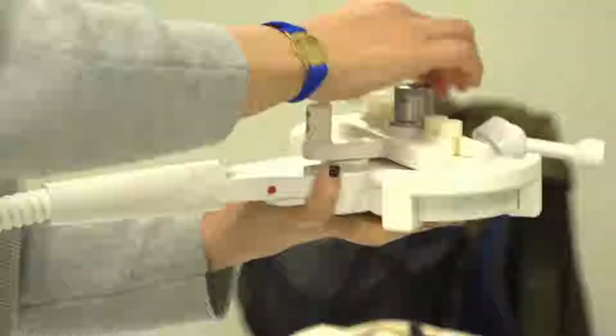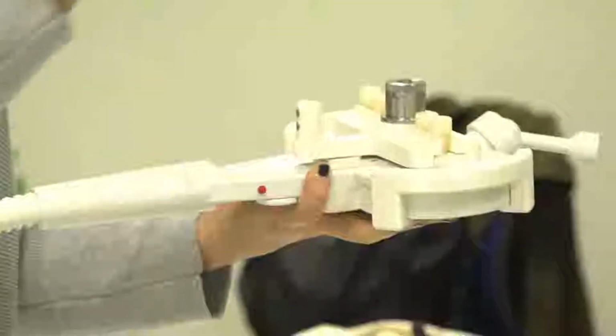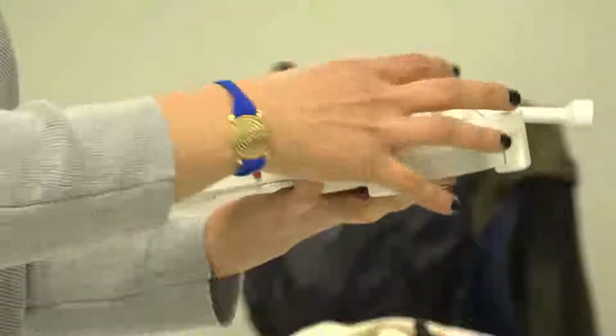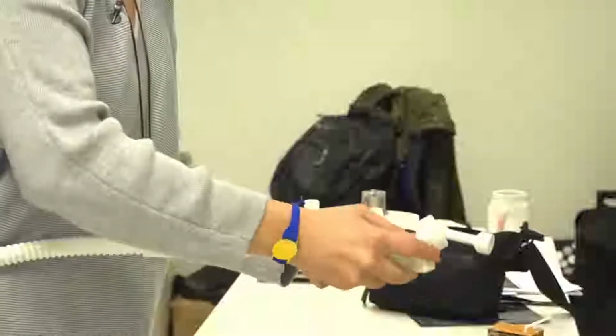I have tested several ways of holding the coil, and we have some ways to have it there, but not with this type of chin rest, because it doesn't give me what I want. So you can remove it. I don't want to remove it completely, but I want to show you that it's not part of the coil.